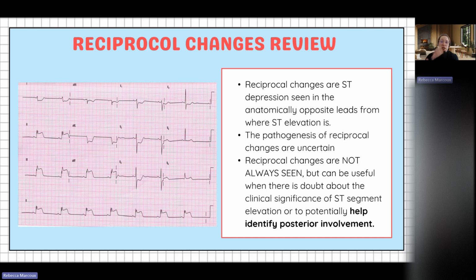Again, our reciprocal changes are ST depression seen in our anatomically opposite leads from where the ST elevation is. Surprisingly, the pathogenesis of this is unknown. In the literature, it's talked about, but no one knows the reason why these reciprocal changes happen. The biggest takeaway as well, though, is that we don't always see reciprocal changes.